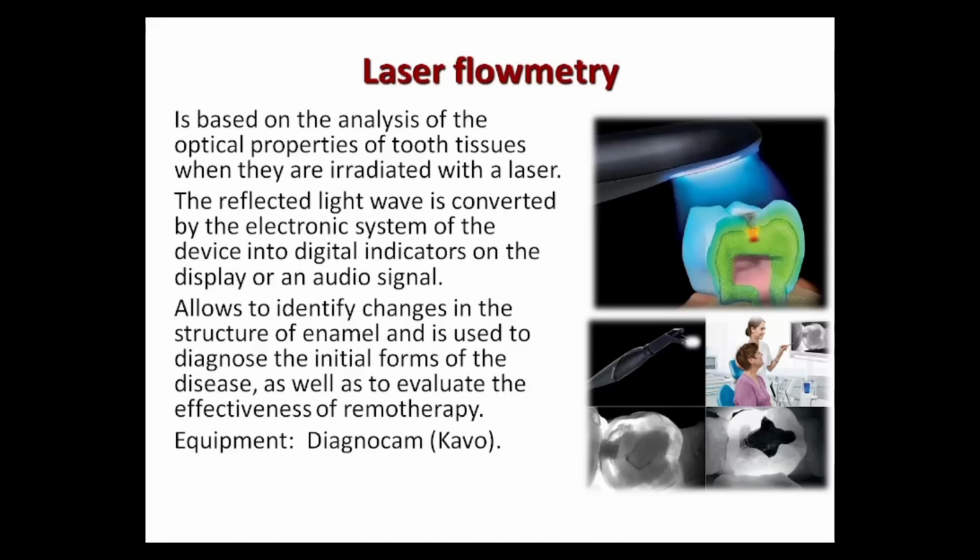The reflected light wave is converted by the electronic system of the device into digital indicators on the display, or an audio signal, allows to identify changes in the structure of enamel, and is used to diagnose the initial forms of the disease, as well as to evaluate the effectiveness of remineralization therapy.